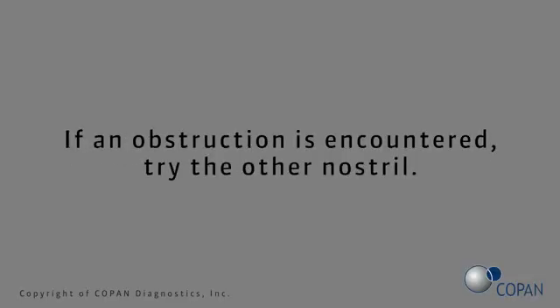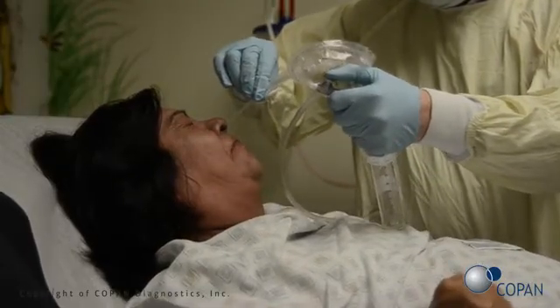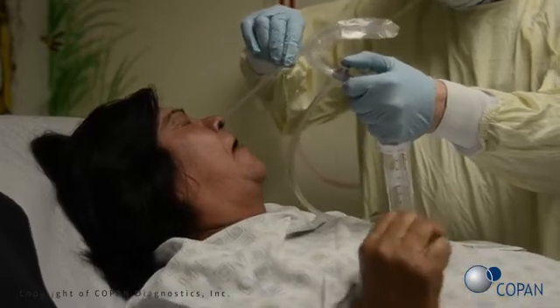If an obstruction is encountered, try the other nostril. Using a smooth motion, quickly push and then pull the syringe plunger to expel and aspirate the saline.